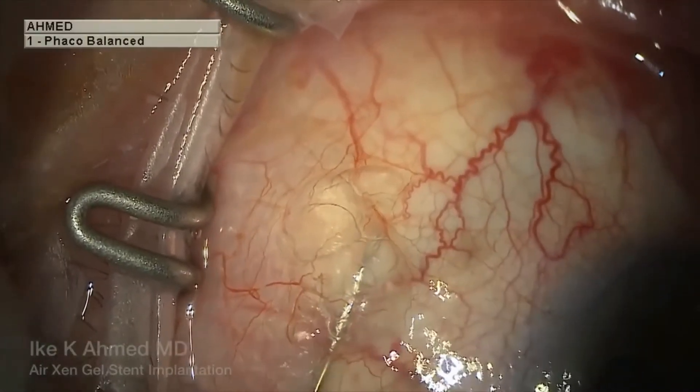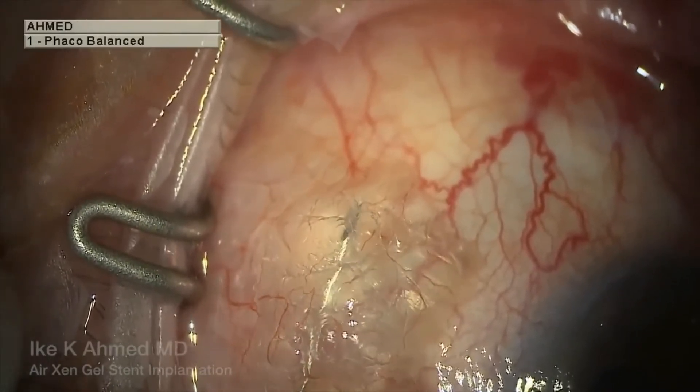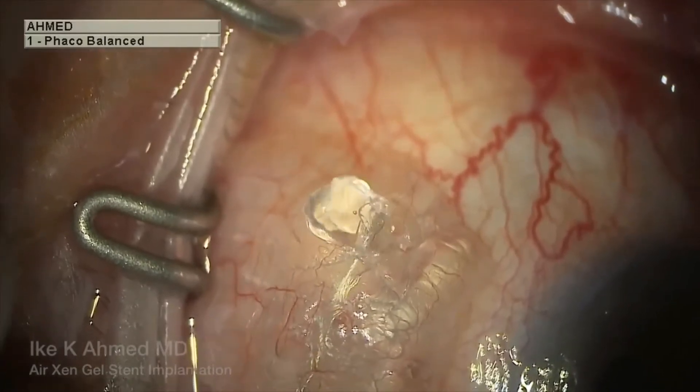We also present the Air Xen technique, which was developed by my co-author, Ike Ahmed, with the intention to help you achieve a sub-Tenon placement of the stent.